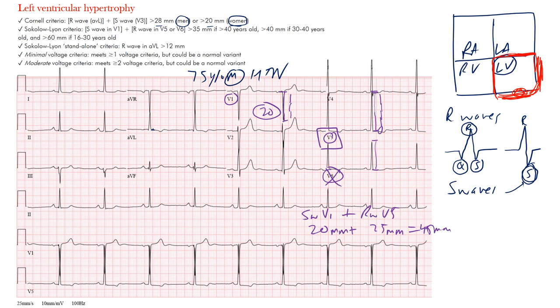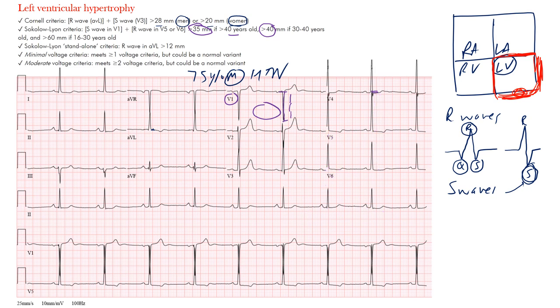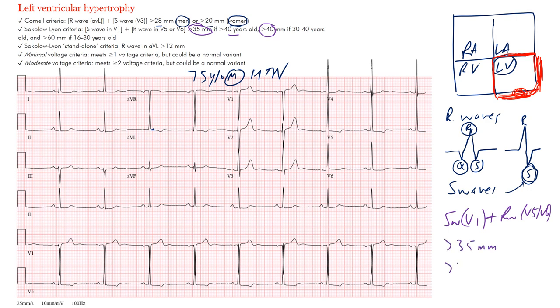The R wave in V5 counts up to about 25 millimeters, so 20 plus 25 is 45 millimeters. That exceeds the threshold. For a male over age 40, the Sokolow-Lyon criteria requires greater than 35 millimeters, which is certainly met here. So this patient does meet the Sokolow-Lyon criteria — S wave in V1 plus R wave in V5 or V6 should be greater than 35 millimeters for patients over 40, or greater than 40 millimeters for patients between ages 30 and 40.